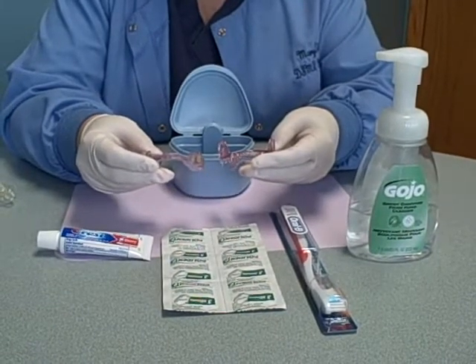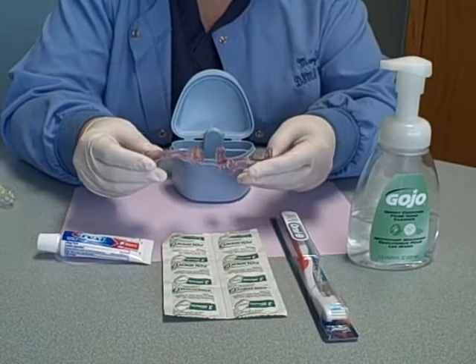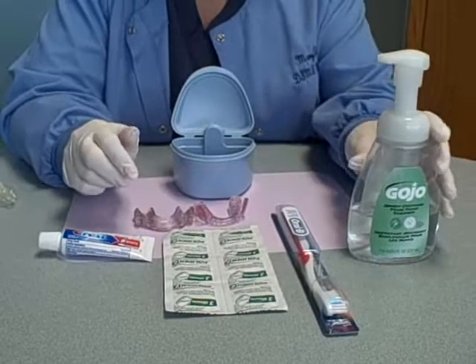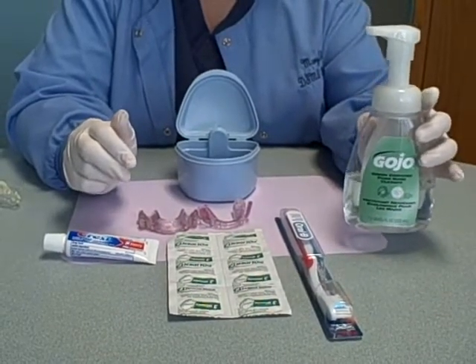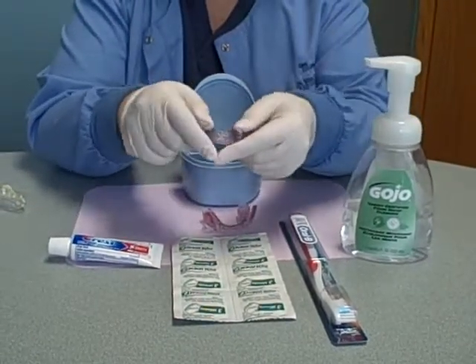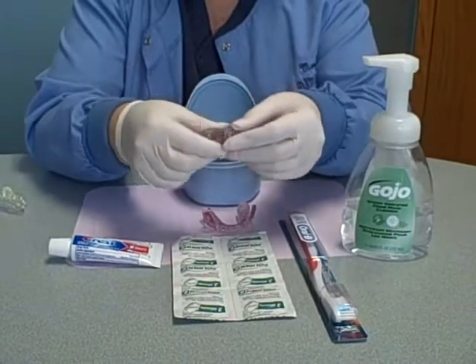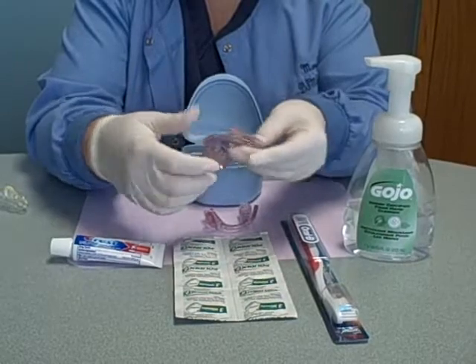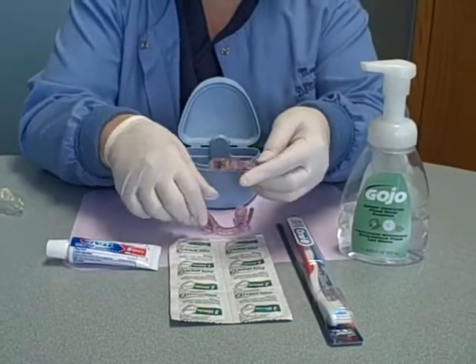When you take your appliance out in the morning after you've worn it all night, you can cleanse your appliance two different ways. One, you can use a liquid soap — an antibacterial liquid soap like a dish soap or a hand soap. Give it a squeeze, rub this in, or you can use a soft toothbrush and brush it in. Everything gets cleaned and brushed, especially in the area used to adjust your oral appliance.